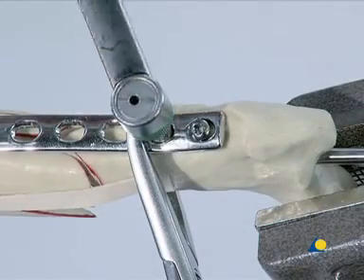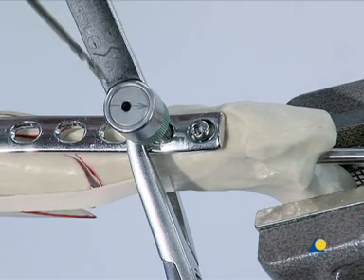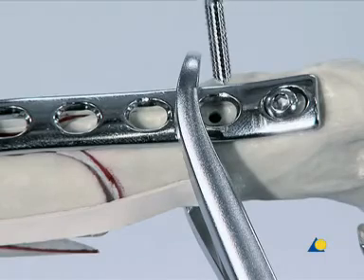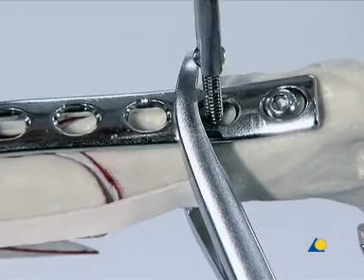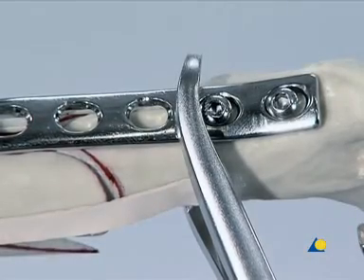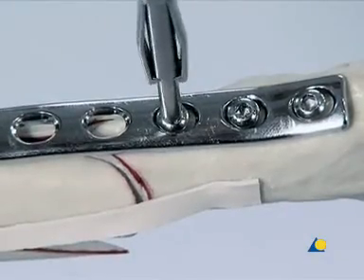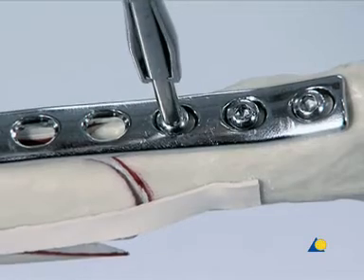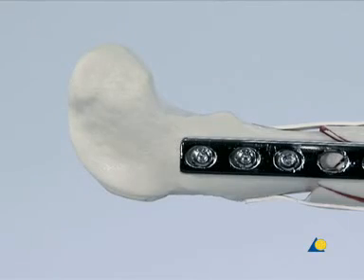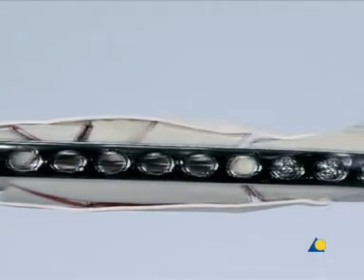Another buttress screw is inserted at the proximal end of the plate. If the tip of the drill comes into contact with the intramedullary pin, a monocortical screw can be used instead of a bicortical screw. However, there should be a minimum of six cortices engaged in each major bone segment. The forceps is now removed. A third proximal screw is inserted in the same manner, and the procedure is repeated at the distal end of the plate. The plate holes over the comminuted area are left empty.